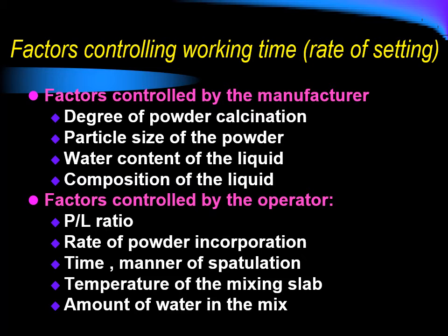Also, the amount of water in the mix can change the rate of setting and the working time.